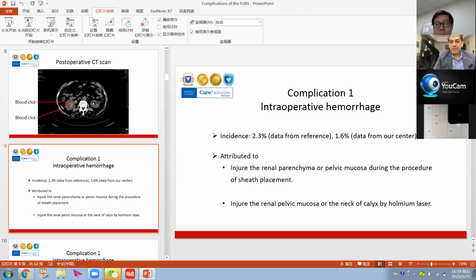Okay. Regarding, so let's go one by one, because with many questions we can forget. So let's answer one by one. Dr. Wang, can you? I will come back to you again. But Dr. Wang, do you prefer to have a retrograde intrarenal pyelography before you start, to give you more idea about the anatomy, the position of the stone, and any complexity of the pelvicalyceal system, or is it not routine work?